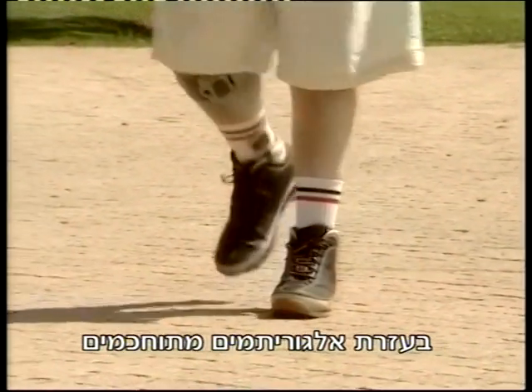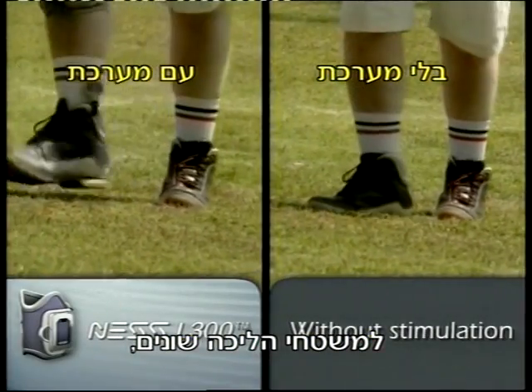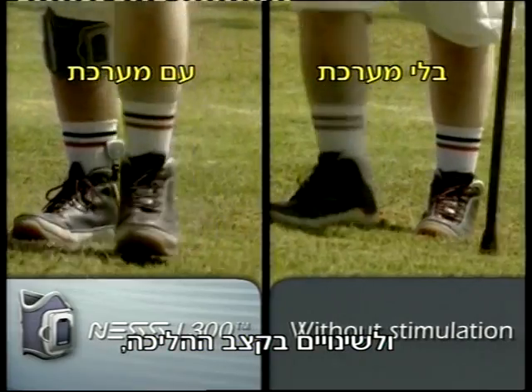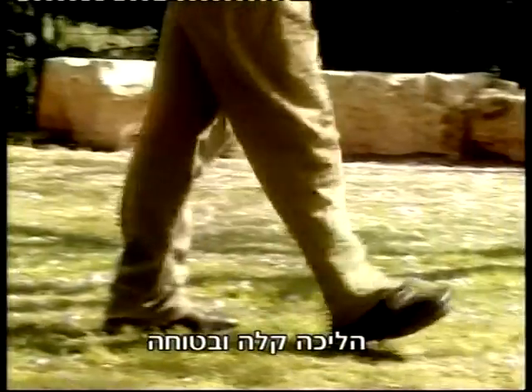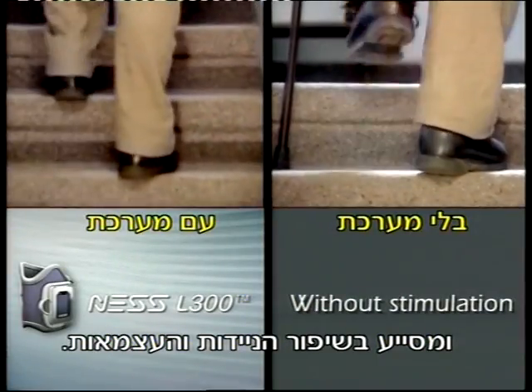Sophisticated algorithms are utilized by the Ness L300 in order to automatically adjust to different surfaces, walking speeds, and uneven ground. This enables the user to walk with greater confidence and ease, leading to increased mobility and independence.